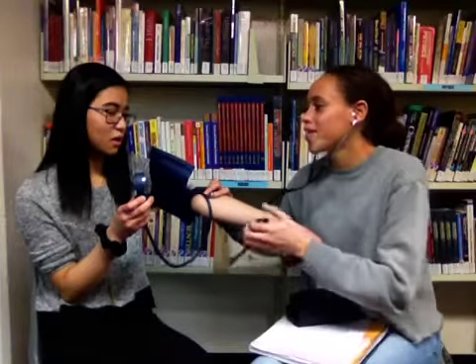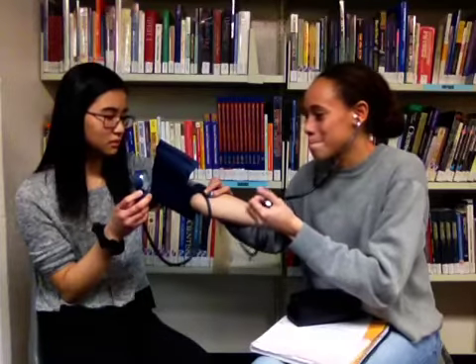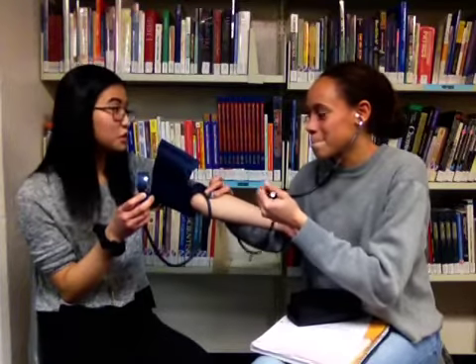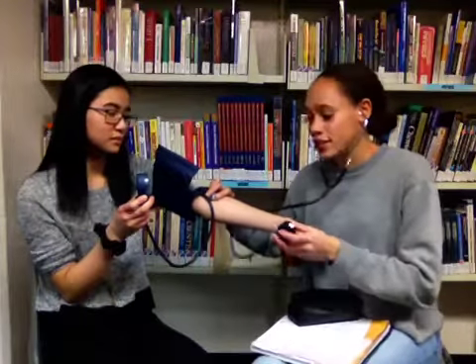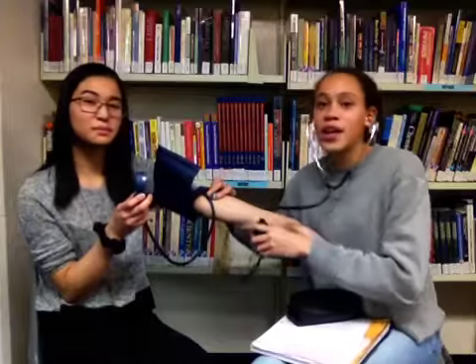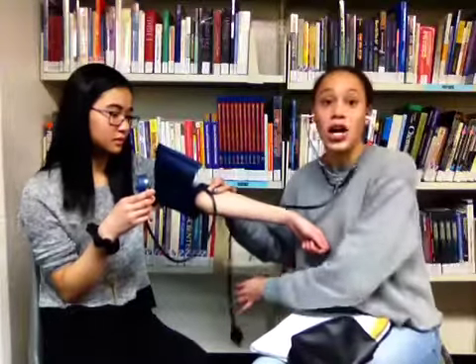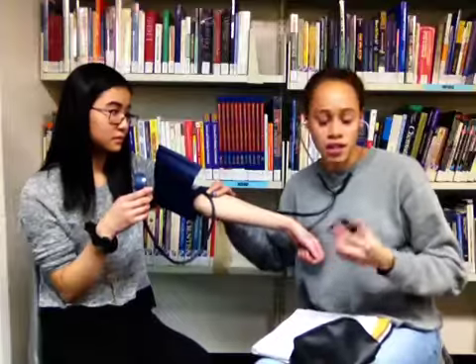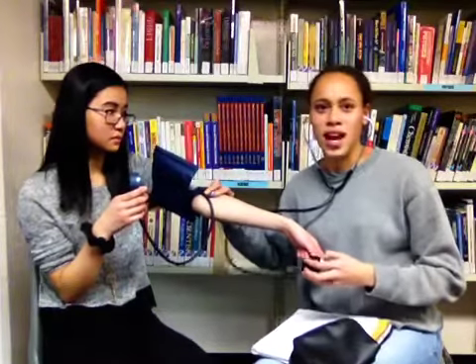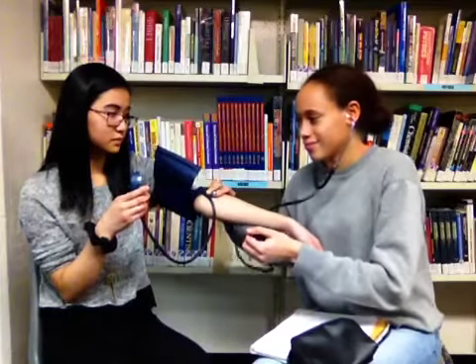Very quick, nothing hard. Once it gets to 200, you're slowly going to deflate it, and you're going to listen for the first sound, which will show you the systolic pressure. Then when you hear it start to slowly slow down and eventually stop, that is the diastolic pressure.